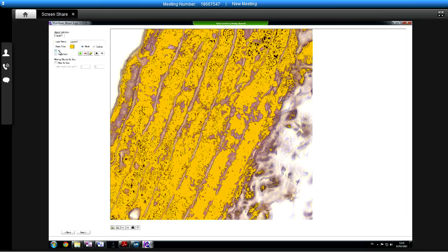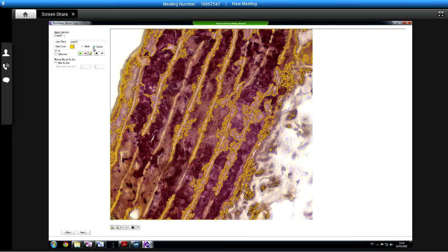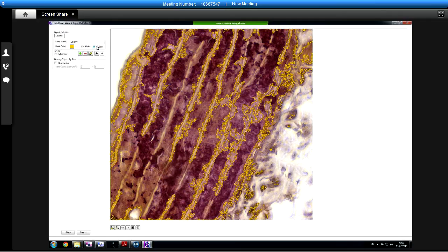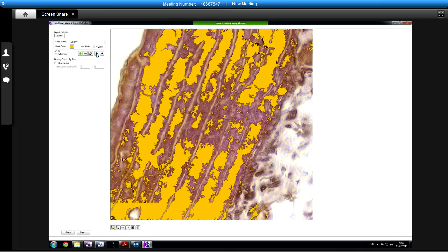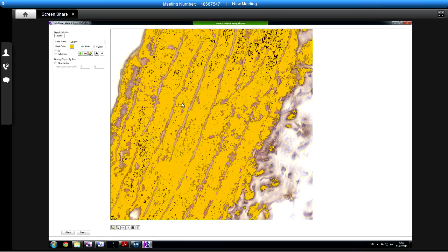Is there anything in amongst this that you wouldn't really say? It's not counting the bits within there. I think under here, like those lines there. Other lines aren't being counted. Oh, I see, these lines should go all the way down, shouldn't they? What's underneath there? But the strips down the middle should be. Is that closer?